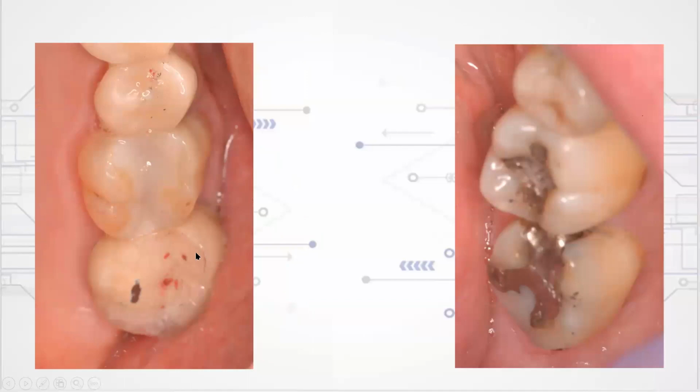So here I've done my bite adjusting on the crown. I actually exposed metal. And we tell the patients if we're going to adjust their bite and they have crowns that we might expose the metal in advance. They have to give us permission to do that. I've obviously reduced the amount of surface contact, but this doesn't mean it's good. Any one of these could still be high force. There's no way to know. The only way to know is to remeasure, right?